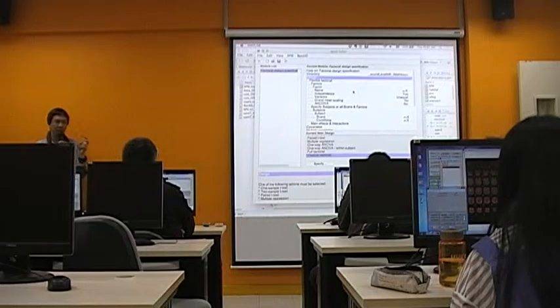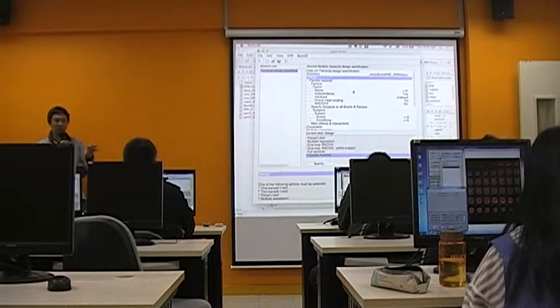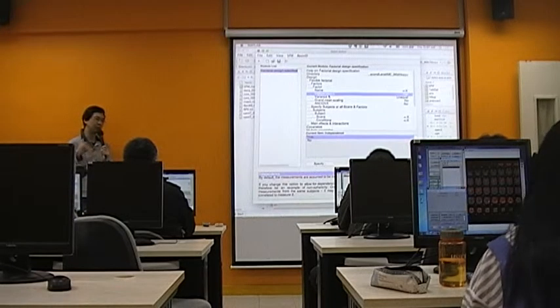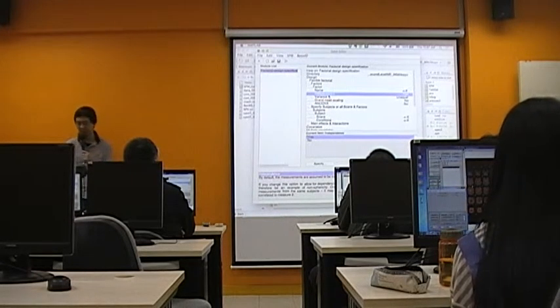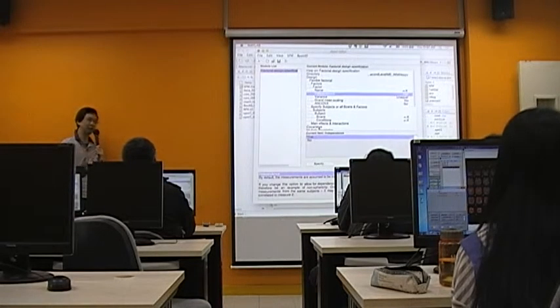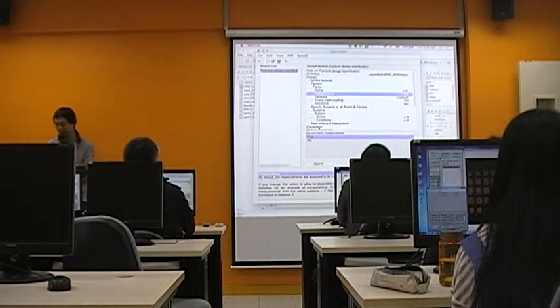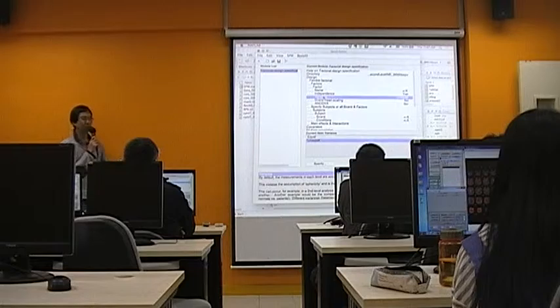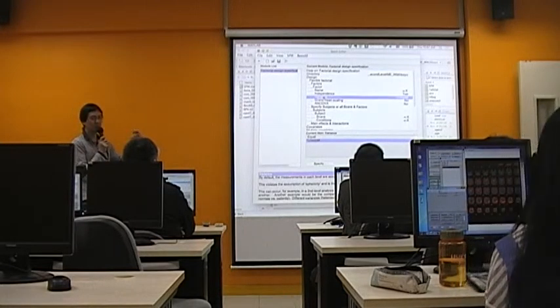So that's why, for each factor you define in the flexible factorial design, you have two things to think about. First of all, whether the observation is independent for this factor or not. If it is a within subject factor, then you say no, they are not independent. If it is a factor concerning individual differences, then they are independent. Okay. So this is the first thing, and then you could assume whether the variance observed in this factor is equal or not.